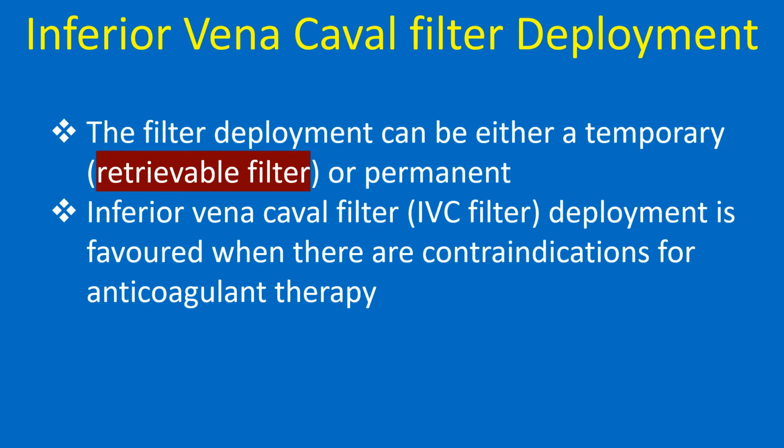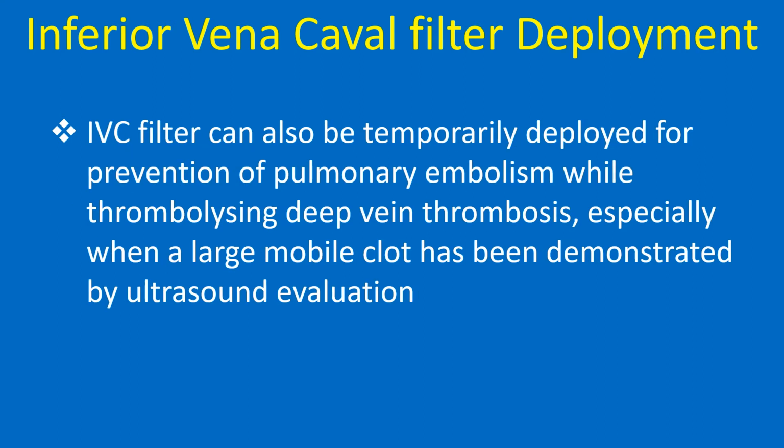IVC filter deployment is favored when there are contraindications for anticoagulant therapy. IVC filter can also be temporarily deployed for prevention of pulmonary embolism while thrombolysing deep vein thrombosis, especially when a large mobile clot has been demonstrated by ultrasound evaluation.